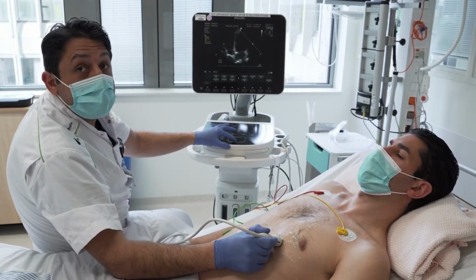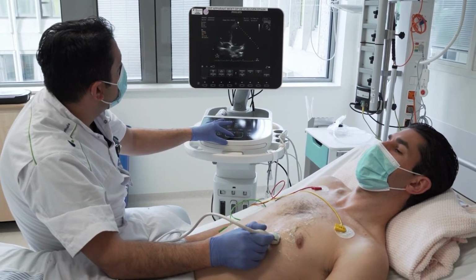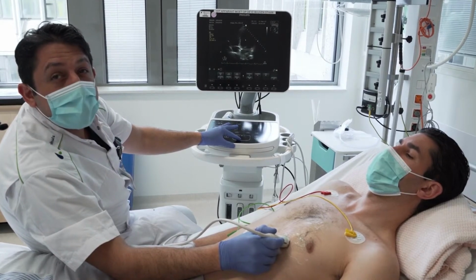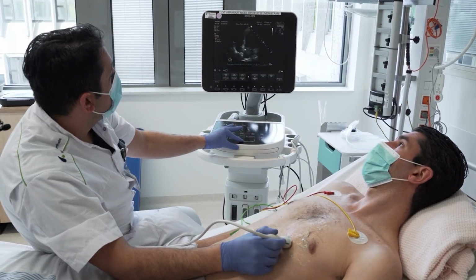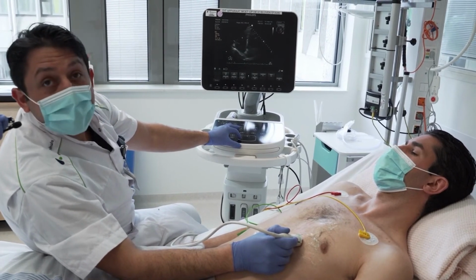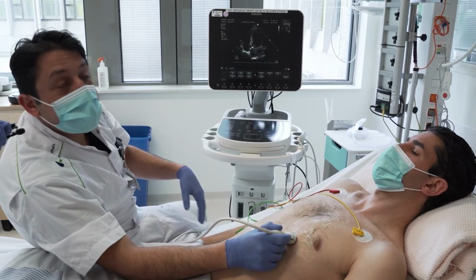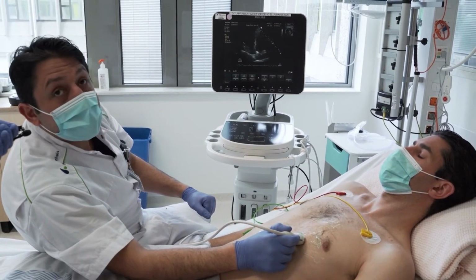So the apex will be just below your probe. The left apex here, where the arrow is in the window on this monitor, and we see the left ventricle directly under your probe, and left atrium, right atrium, and right ventricle, and just see the morphological differences and orientate where the left ventricle is and so on for your further marks for echocardiography of the heart.